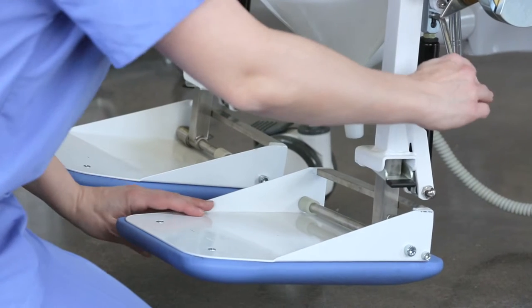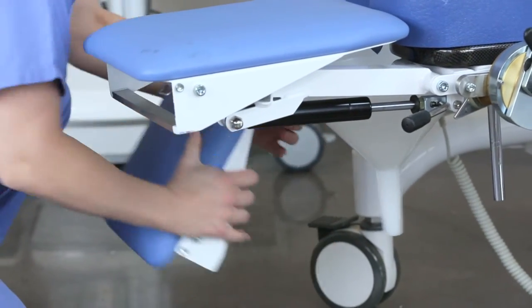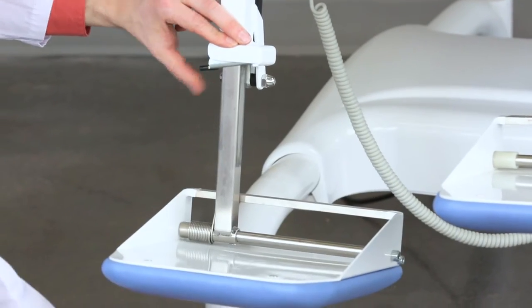To convert the footrests to become an extension to the seat, lift and push in the black lever while lifting the footrests up. The length of the footrest can be adjusted by pushing in the second black lever on the side.